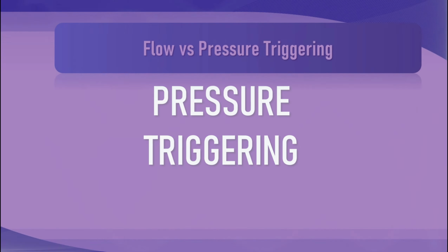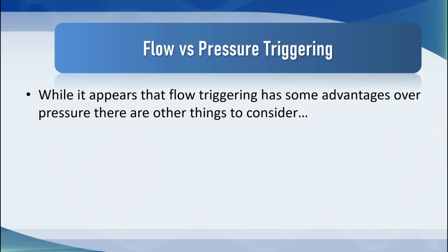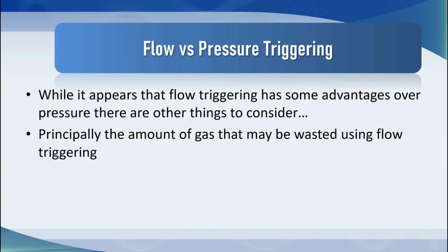Let's move on to pressure triggering. If, for example, we're finding it difficult to get Eddie set on flow triggering, we may consider pressure triggering. And although many consider pressure triggering to be a dated concept, I disagree. While it appears that flow triggering has some advantages over pressure, particularly it is easier to really fine-tune flow triggering, there are other things to consider, particularly the amount of gas that may be wasted using flow triggering.